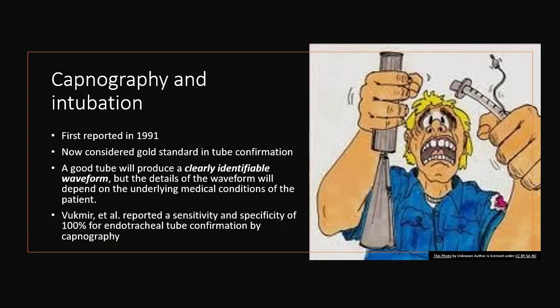The assumption is it was a gut tube the whole time. Now, here's another thing: you have to do it immediately. So if you get your intubation, you move on to other things, then you put on your end-tidal CO2 10 minutes later, has it done you any good? No. Because you had 10 minutes of potential time when the tube could possibly have been dislodged and you would have had no idea. You need to get it on quickly and promptly.